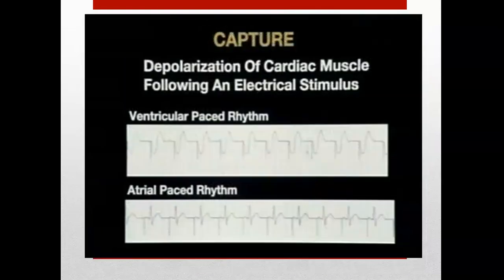Okay, so next we've got capture. So capture occurs when the appropriate waveform is present following the pacemaker spike. Capture indicates a depolarization of the cardiac muscle that follows the electrical impulse, or the electrical stimulus.